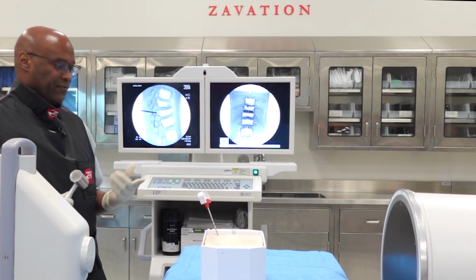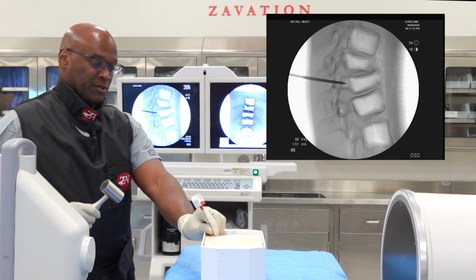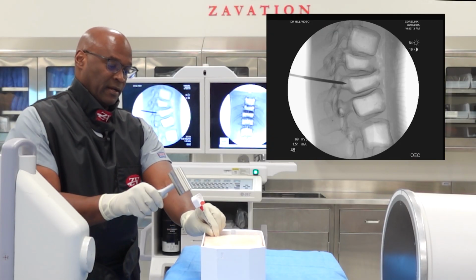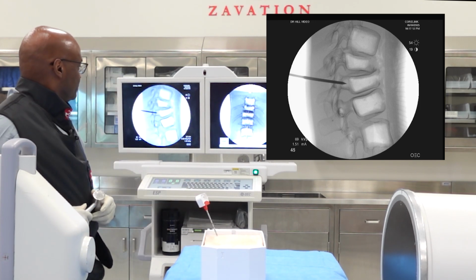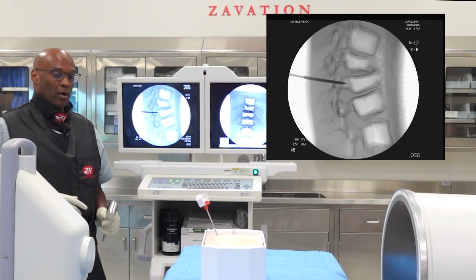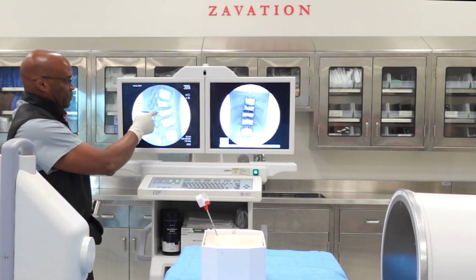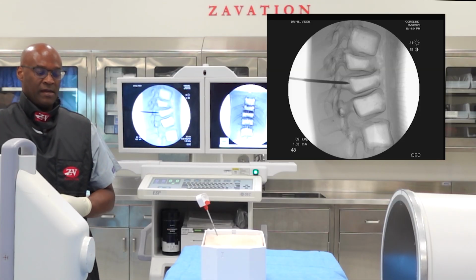And as you can see, we've entered into the pedicle. And what we want to do is try to maintain our trajectory down the pedicle. Excellent. And we're entering the pedicle. Now the important part that you see here is that the tip of the needle is near the vertebral body. So we'll go back to an AP.